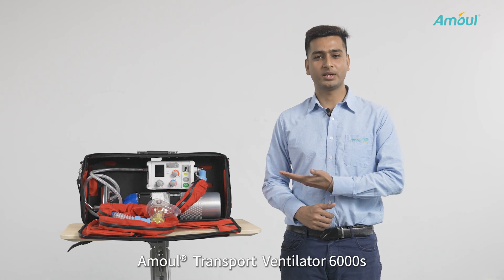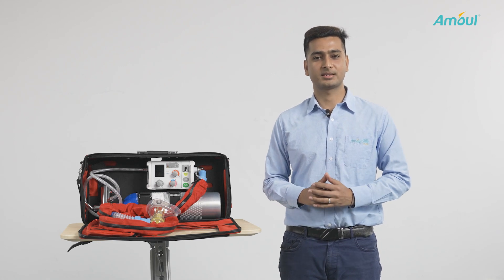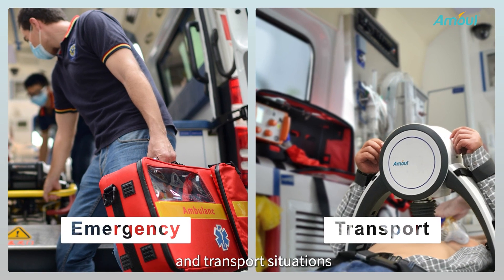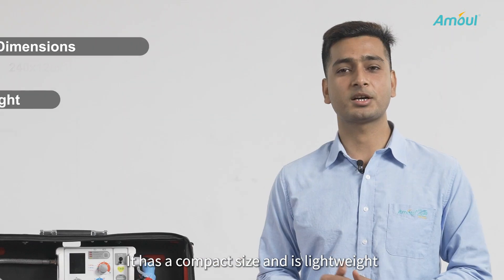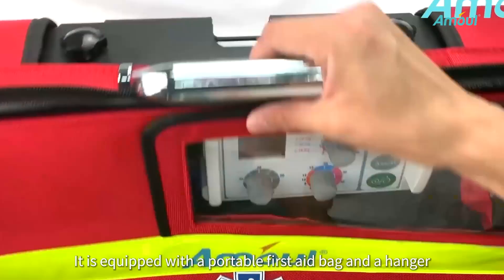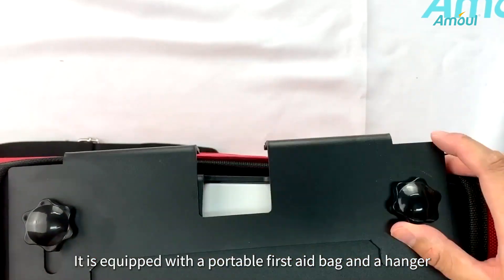The Amoul Transport Ventilator 6000S is the best rescuer in different emergency and transport situations. It has a compact size and lightweight of only about 1.3 kg, and it is equipped with a portable first-aid bag and a hanger.